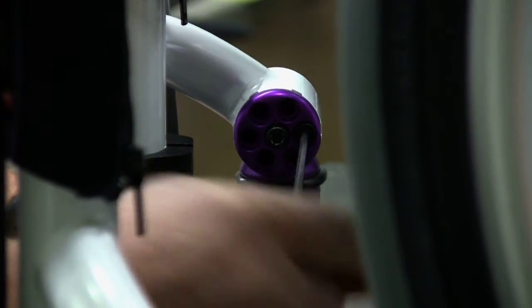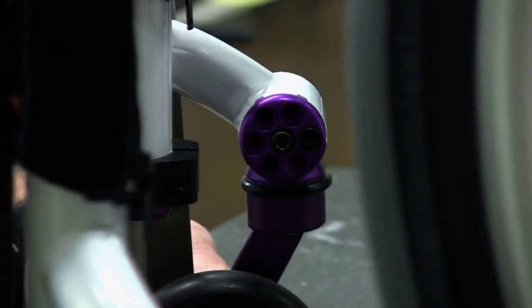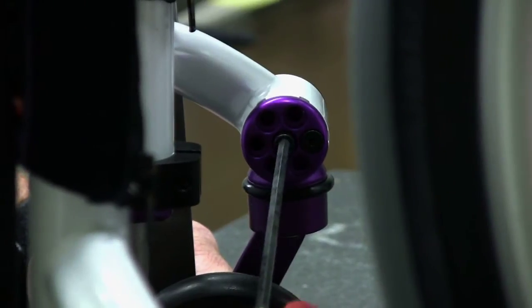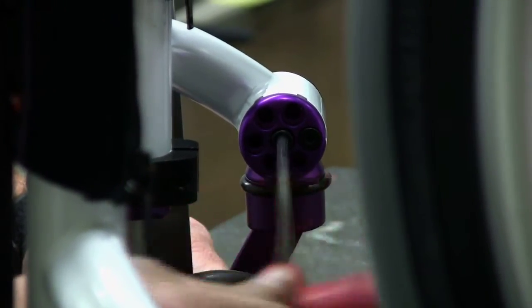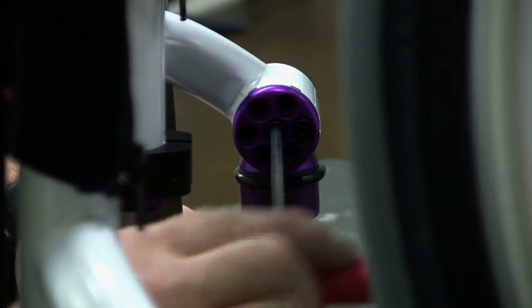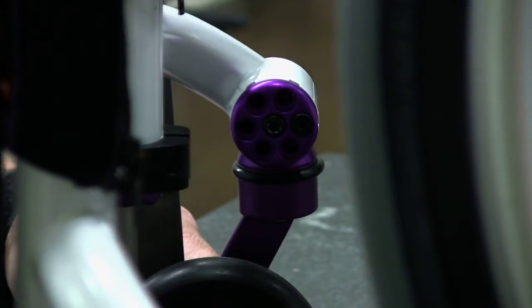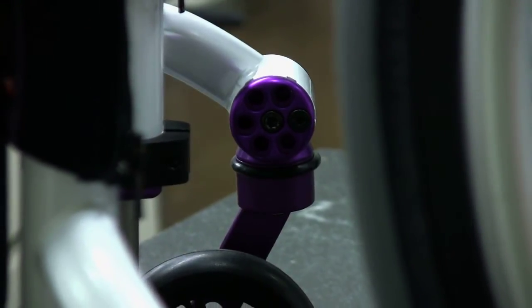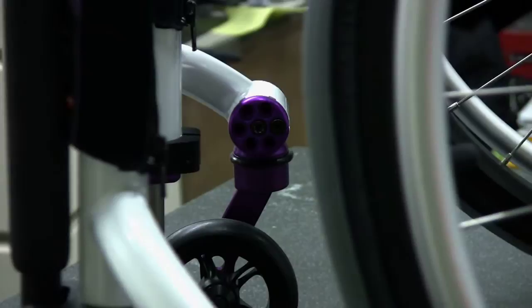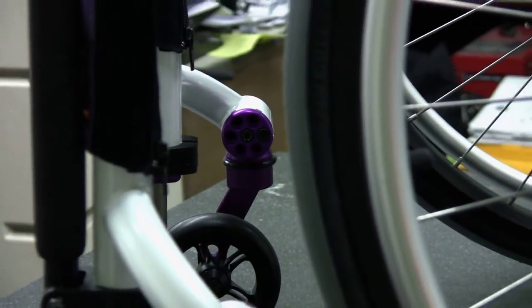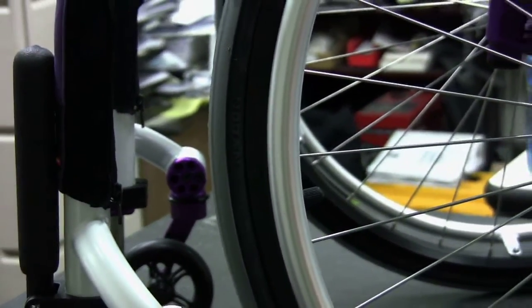Step 6: If not, pull the caster end cap away from the caster housing and rotate the caster end cap one-sixth turn and re-engage the caster end cap tabs in the tab slots. Check alignment again. If it aligns, proceed to step 7. If not, repeat this step using the next combination of caster end cap tabs and tab slots.